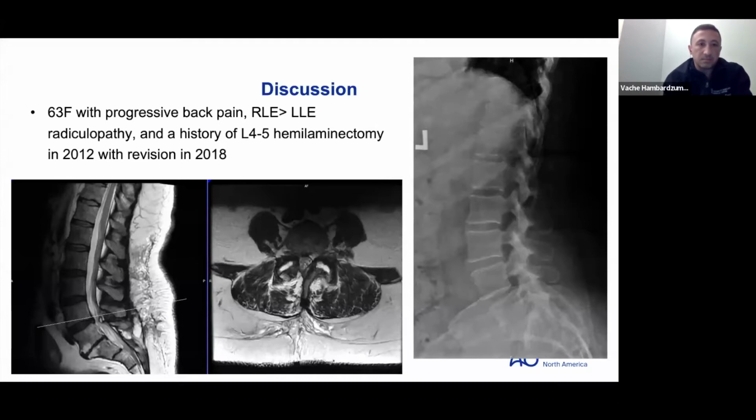Yeah, I almost never use BMP, Eugene, for my interbodies or posterolaterals. My choice of bone graft is typically local bone that I harvest from the facetectomy and the laminectomy, that I put in the cage and put in the posterolateral gutter. If I need to augment it, I typically use crushed cancellous bone with a demineralized bone matrix product to act as a graft extender. What are your thoughts on BMP?